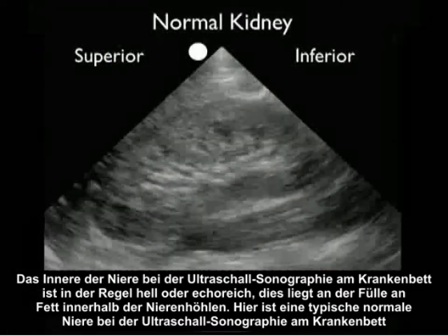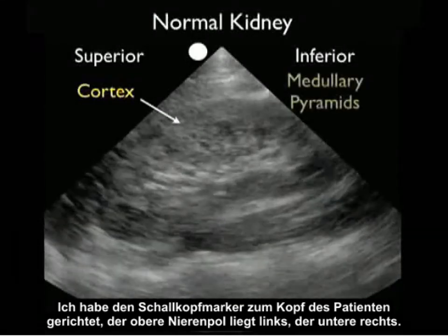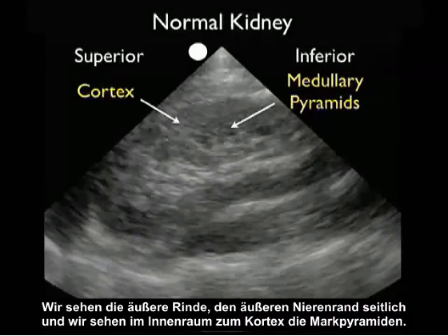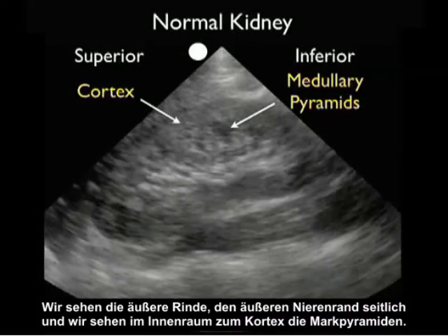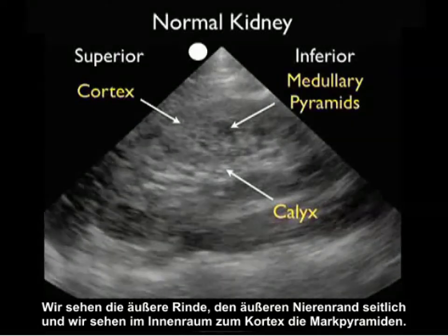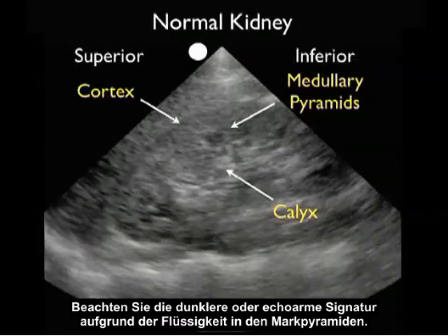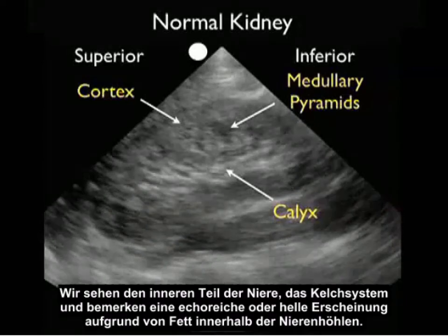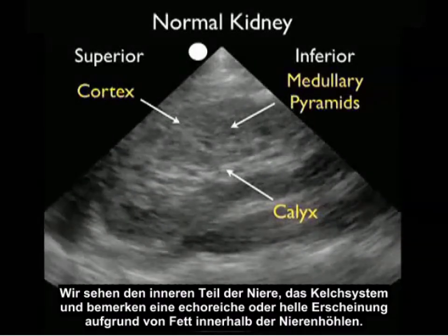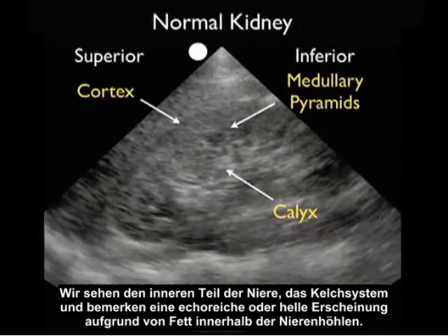Here's a typical normal kidney on bedside ultrasound. The probe marker is oriented towards the patient's head, so the superior pole of the kidney is to the left and inferior to the right. We see the outer cortex as the peripheral rim, and just interior to the cortex are the medullary pyramids, which have a slightly darker or hypoechoic signature due to the presence of fluid within them. We see the inner calyceal region, which has a hyperechoic or bright appearance due to fat within the renal sinuses.